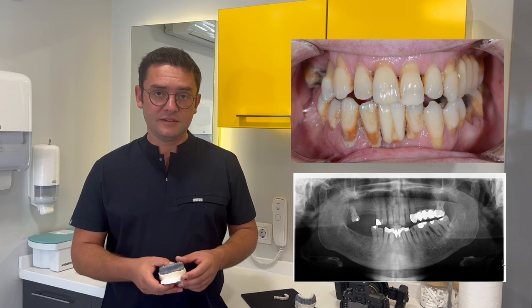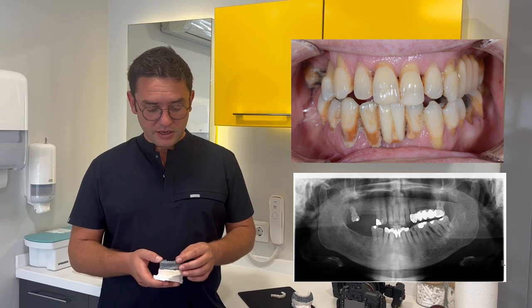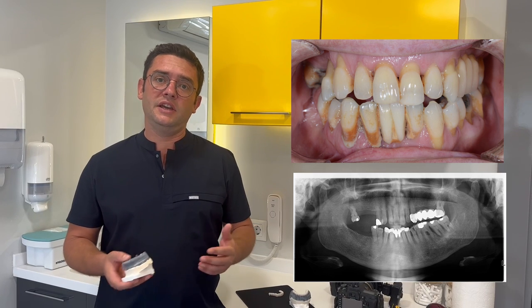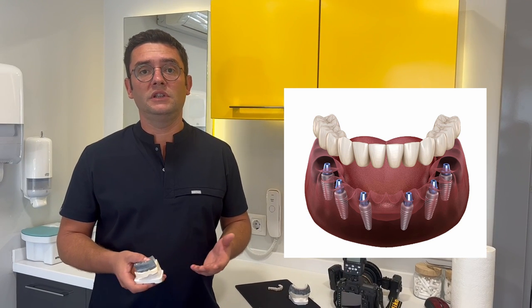Our patient had very bad teeth and we had to remove her old teeth. We had several alternatives like dentures, implant-supported dentures, All-on-4, All-on-6, or more. In our clinic, we generally prefer All-on-6 treatment in these cases.